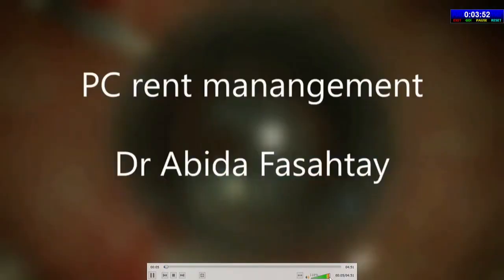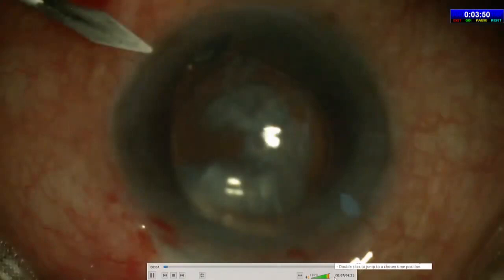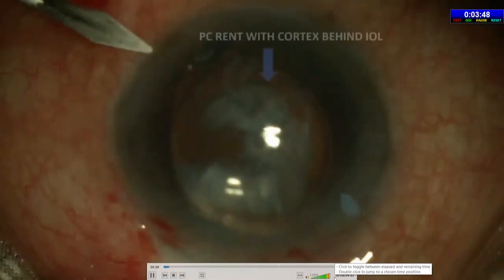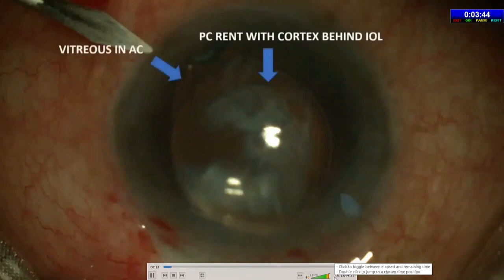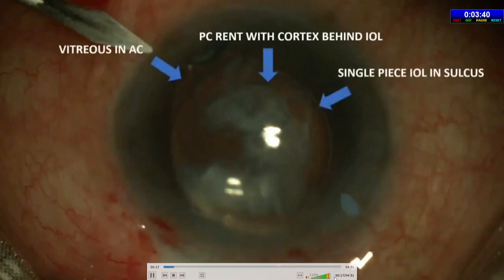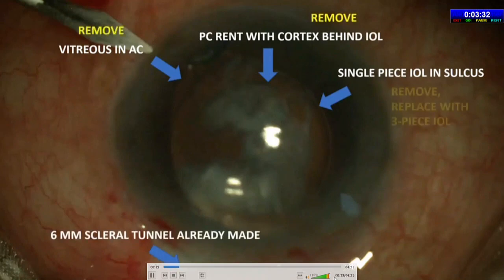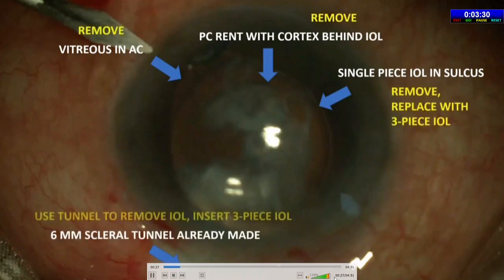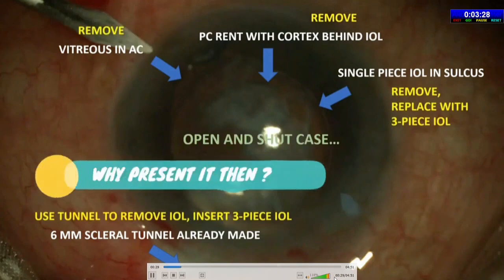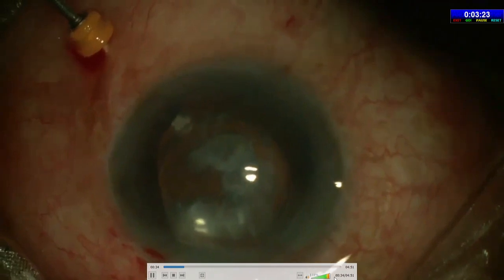To optimize outcomes in tricky situations, the first case is a typical complication of PC rent with cortex behind IOL floating in anterior vitreous, vitreous in AC, and a single-piece IOL which the previous surgeon managed to put in the sulcus through a 6mm tunnel. The game plan seemed simple: remove cortex by anterior vitrectomy, preferably by pars plana approach, remove vitreous from AC, and replace the one-piece with a three-piece IOL through the already-made scleral tunnel. Open and shut case — what is so out of the box?